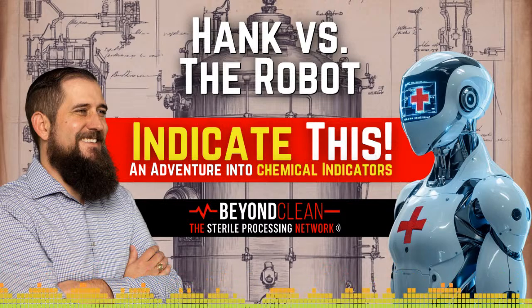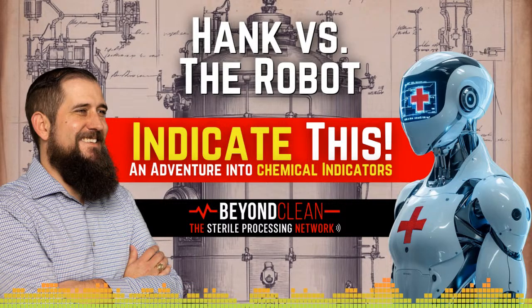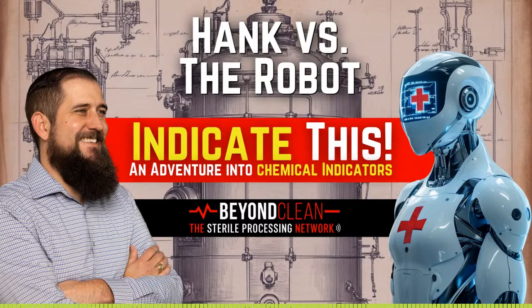Imagine trying to convince surgeons, infection preventionists, or regulatory bodies that a sterilized tray is safe without a physical indicator to show it. It's a tough sell. Those visual cues, whether tape, integrators, or biological indicators, build trust in the process. Could we do it? Sure, we could try. It's not impossible. But sterilization isn't just about killing bugs. It's about proving to everyone involved in patient care that the bugs are dead. Indicators and integrators are part of that proof.